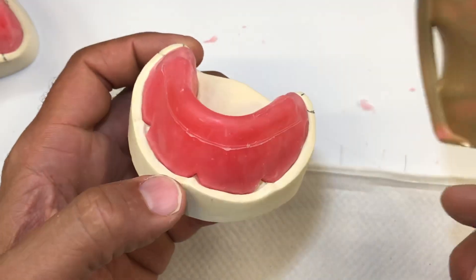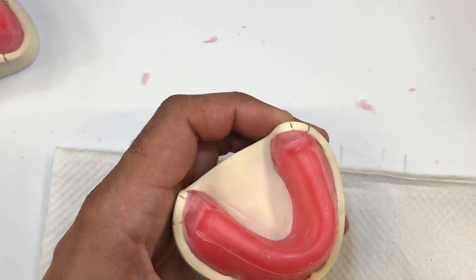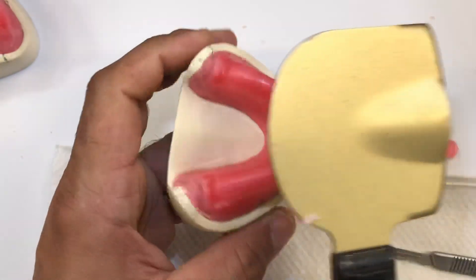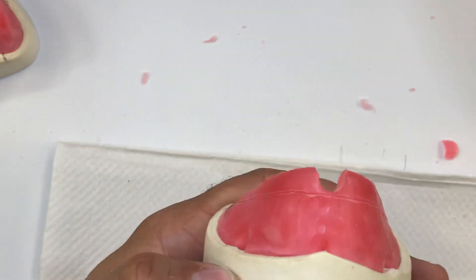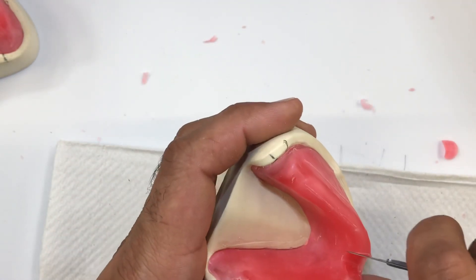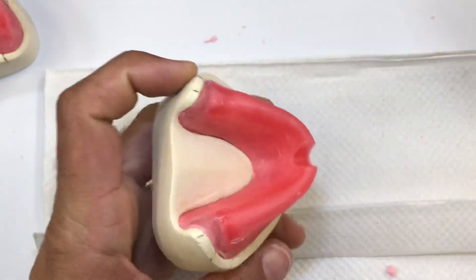This is a little more difficult than the upper because wax is going to flow all over the place and create a mess in the area you've already cleaned up. So over the years I've created a little technique: instead of putting the rim as it normally fits, I'm going to put it on backwards. But before I do so, I create a little opening — almost like a little channel — where the excess wax is going to flow away from the bite block just before my line, maybe a millimeter or half a millimeter before. When I heat up my rim former, I'm going to go the opposite way, and all that excess wax will flow away onto the paper.